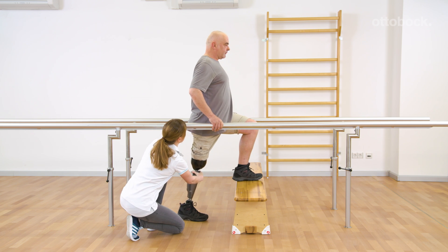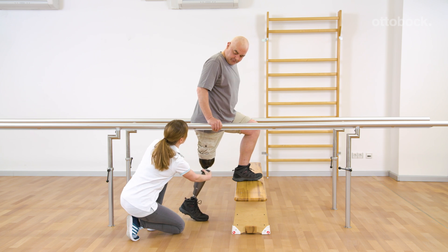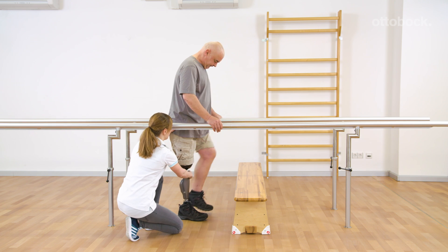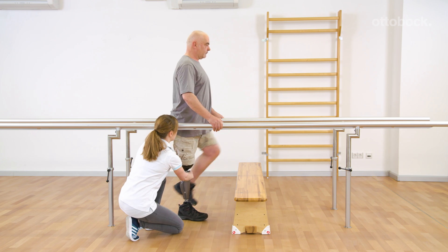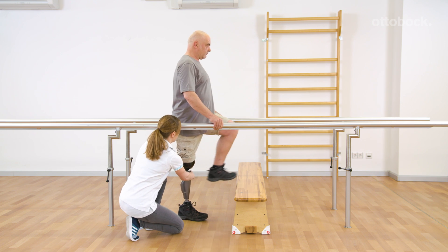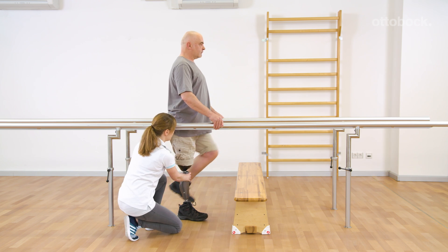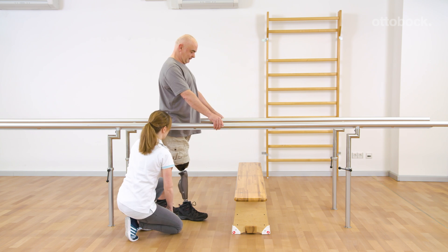If Gerhard has already placed the contralateral foot on the bench and then tries to bend the knee after a slight delay, he bends against the stance flexion resistance. As soon as Gerhard is able to activate the hip extensors, Franziska reduces the security measures.